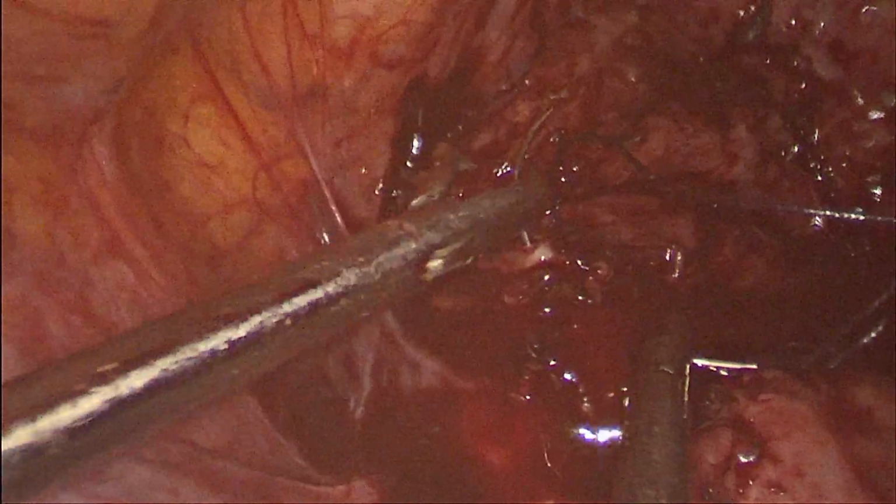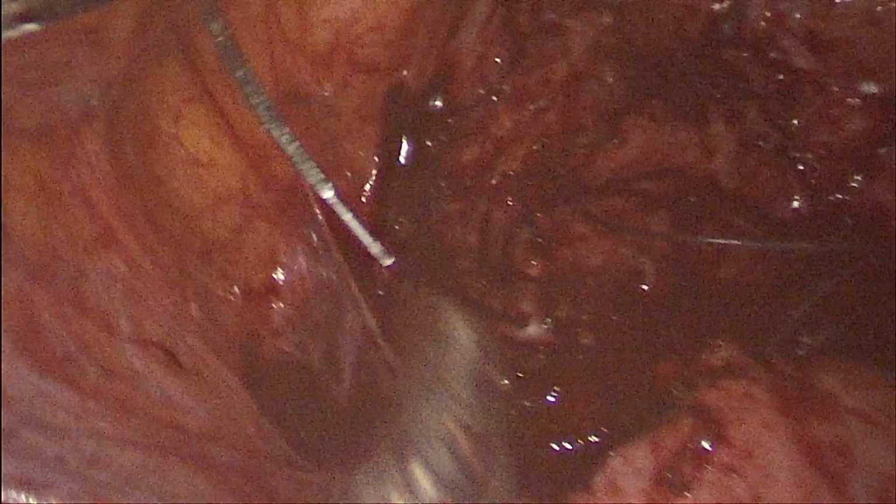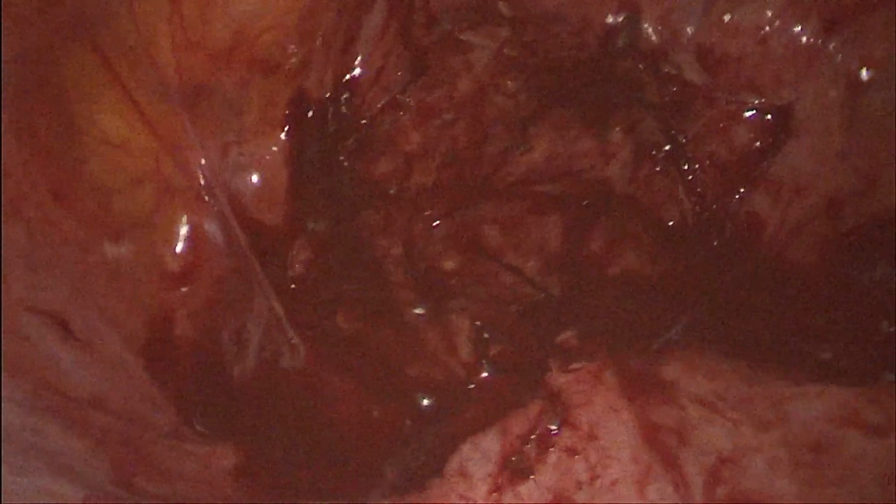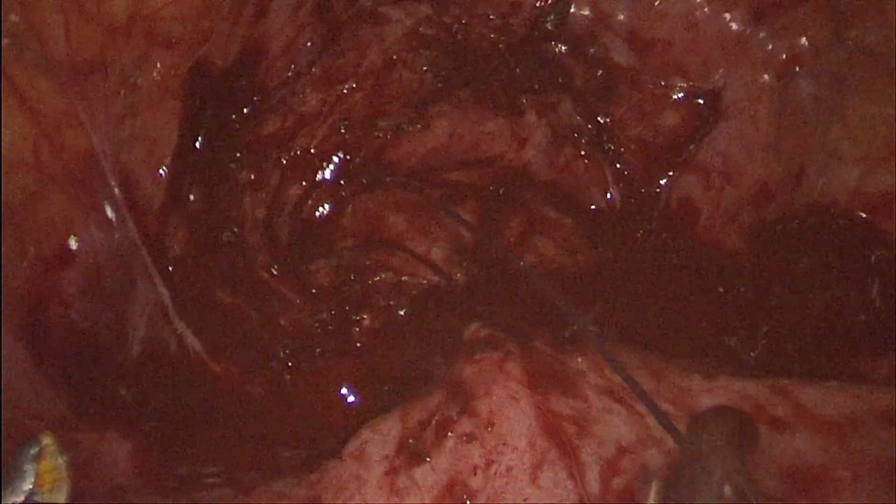So like this, you should take the full thickness where we can see the uterine manipulator, which prevents taking a bite through the posterior wall of the cervix and the uterus.